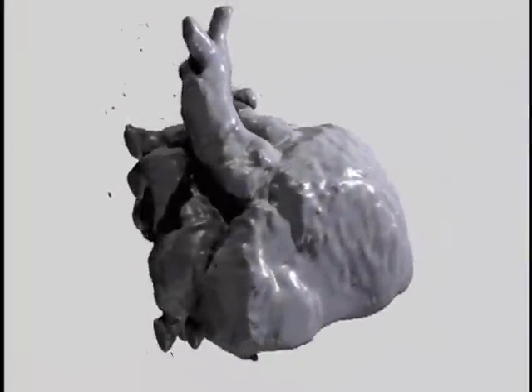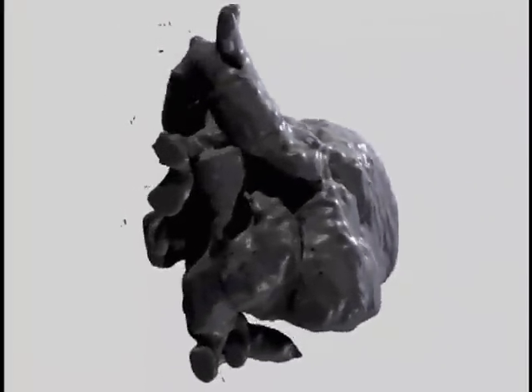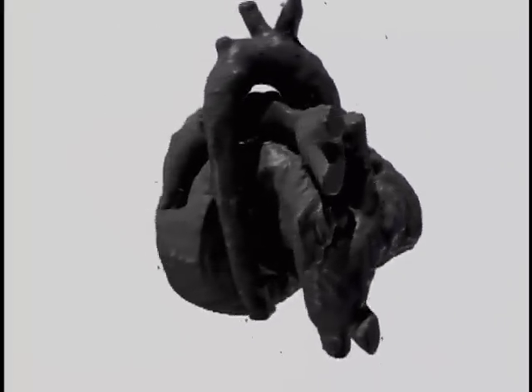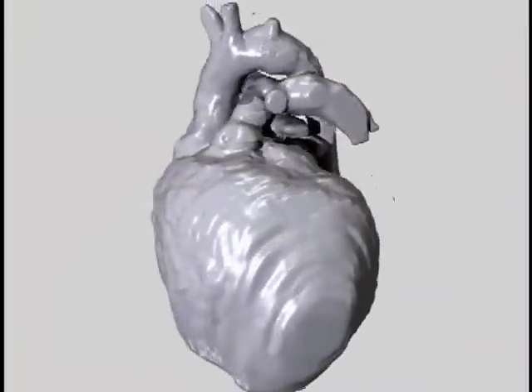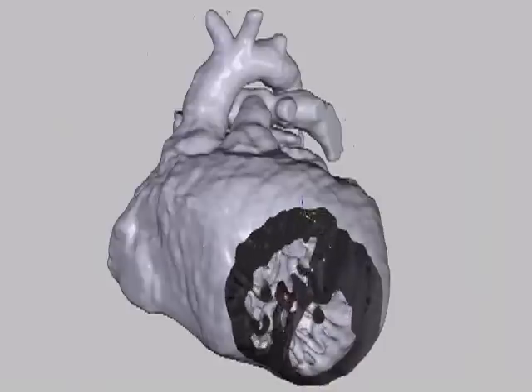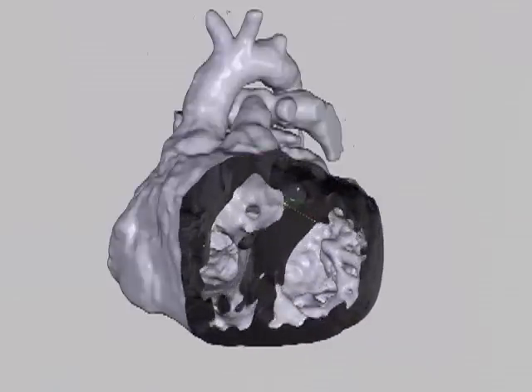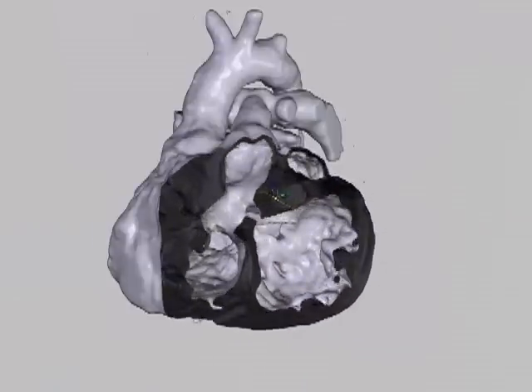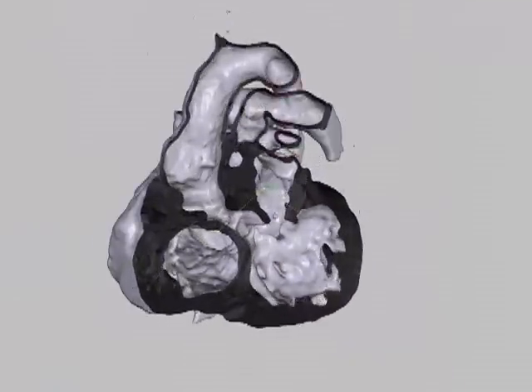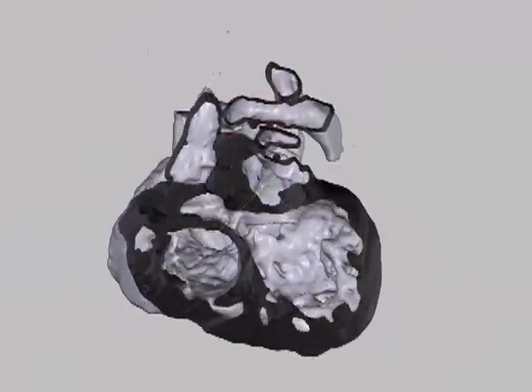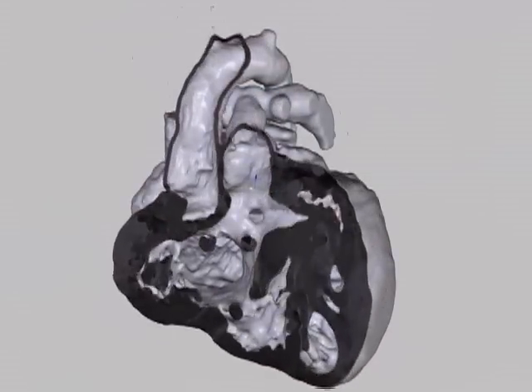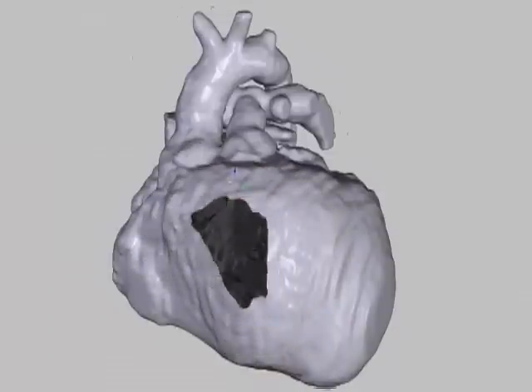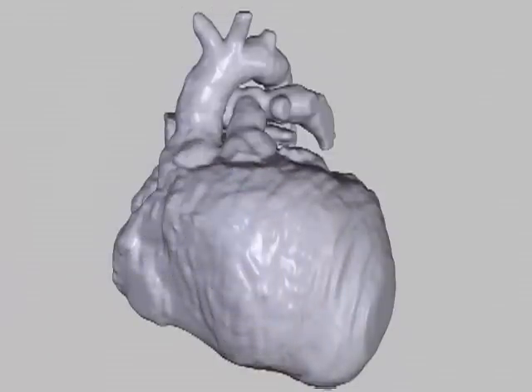With some effort, patient-specific three-dimensional models of the heart can be reconstructed from these MRI datasets. We are looking at the heart of a ten-year-old girl who previously had major surgery. She was born with the diagnosis double-outlet right ventricle.